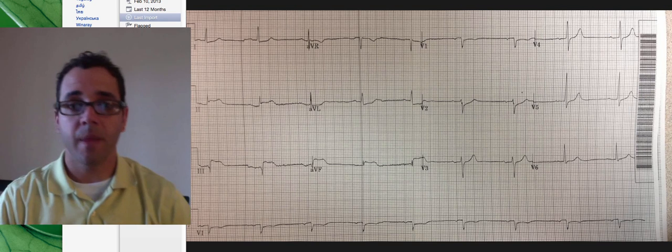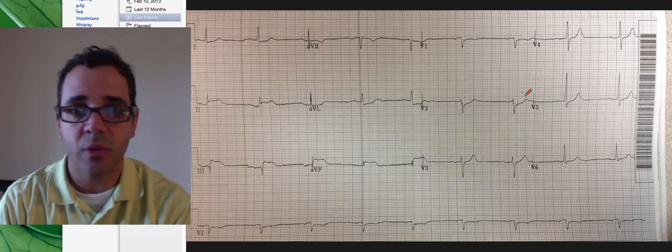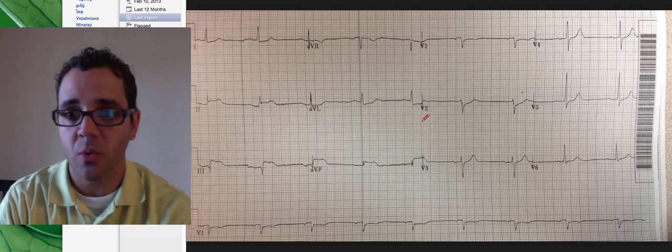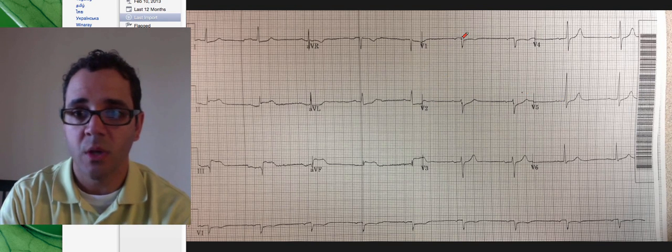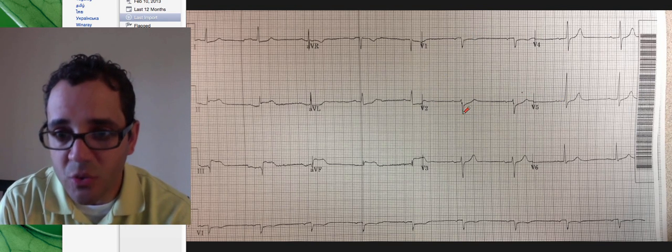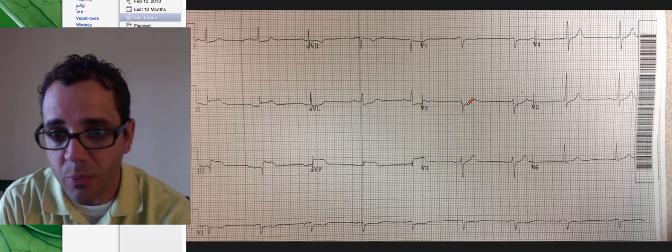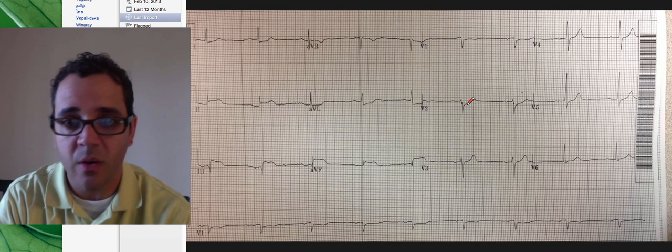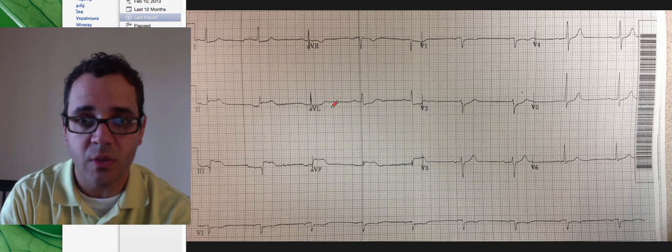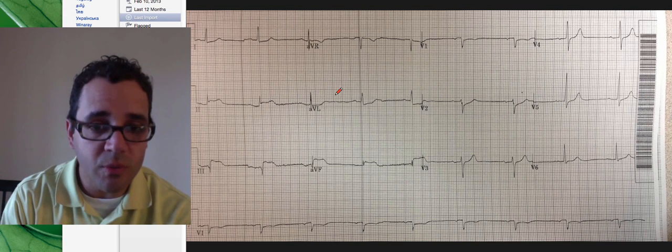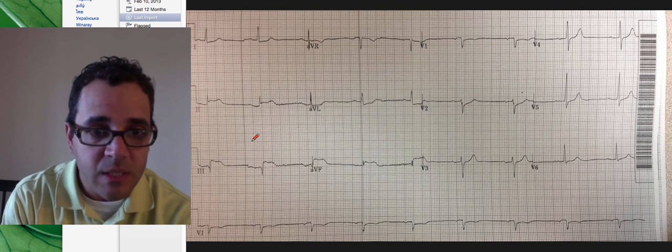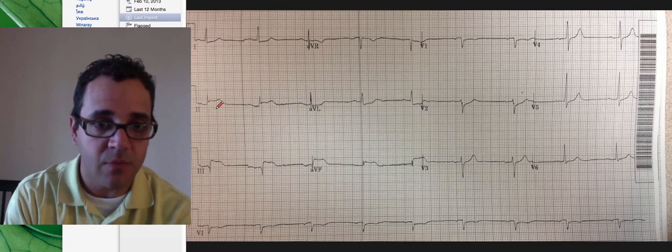Let's see what we see. Initially the rhythm's a little bit slower than the next one. You can see that this looks very different. Those are ST depressions right there. That looks different over here too, but most important is the inferior leads.